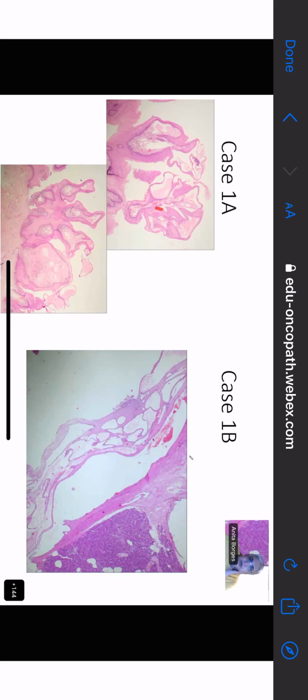And you talked about hemorrhage over here, right? Yes, ma'am. Very good. Now I want to ask you, you are noticing that there is a spot of hemorrhage on the right side and a small congested group of blood vessels on the left side. Is that going to help you to make a diagnosis?